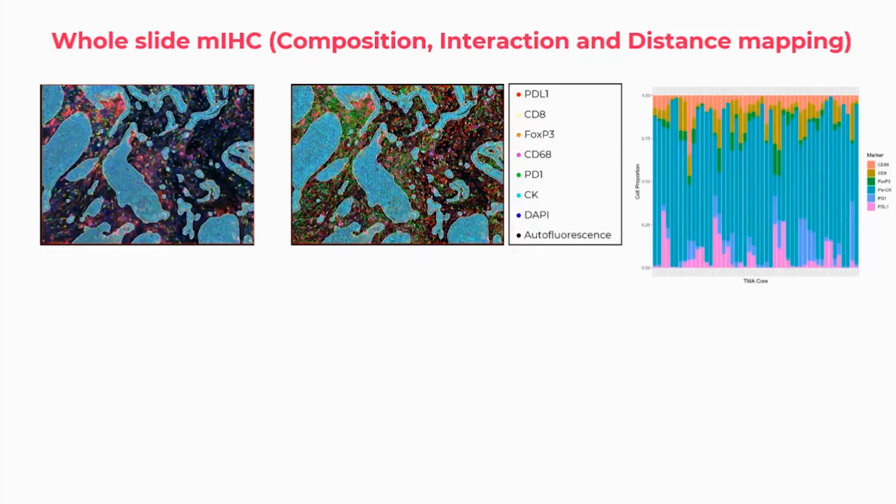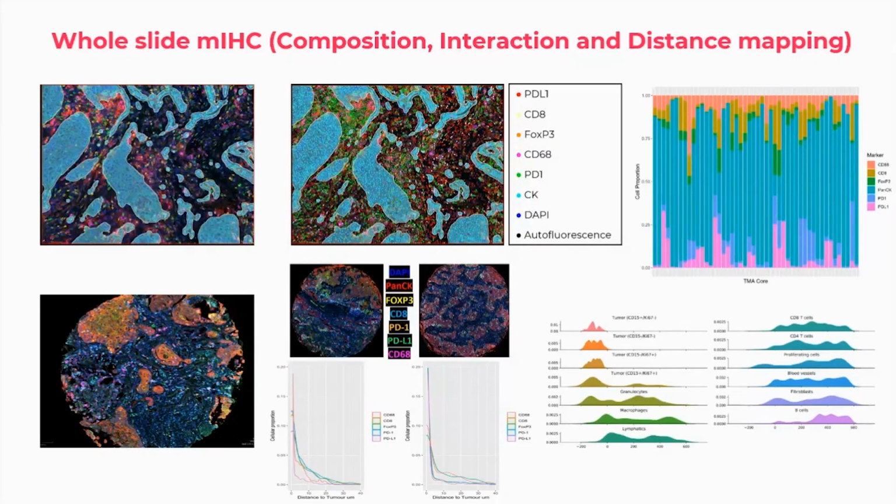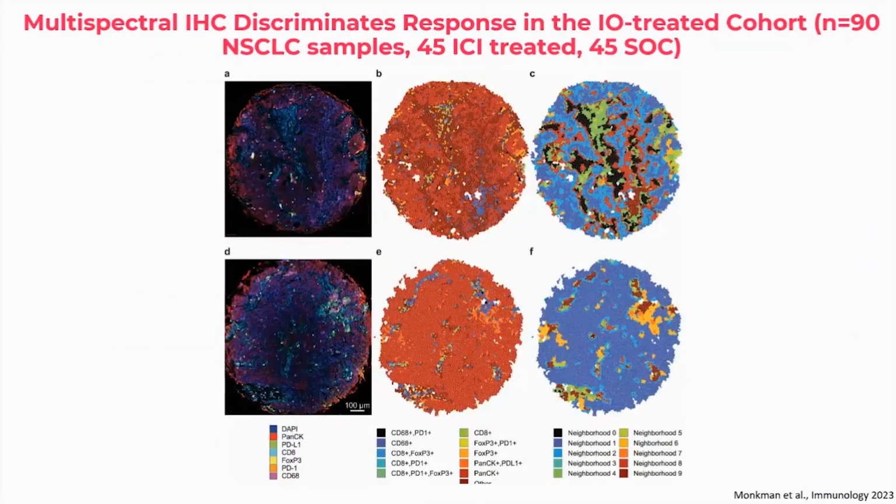And we could look at the composition of each of the cores based on these markers. This is with single cell readout for about 7 different proteins. And we can look at the co-expression of markers as you move into the tumor and as you move into the microenvironment. And so when we've annotated it using this 6 or 7 plex assay, we can then identify the cellular neighborhoods that are present within each tissue microarray core.